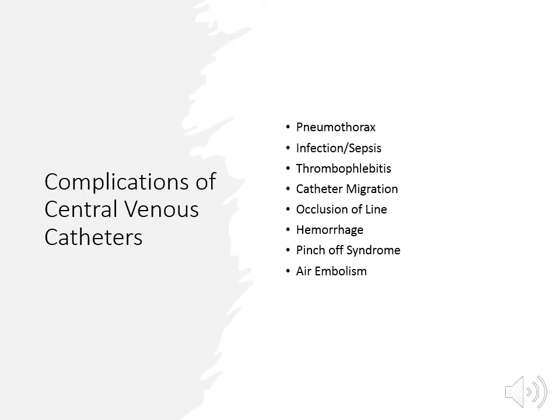Do not force flushes through the catheter. Meds can be instilled in the catheter to dissolve the clot. You would need a doctor's order for that. The current most effective medication is Alteplase. It is a tissue plasminogen activator, aka TPA. The dose is 2 milligrams per 2 mLs instilled times 2 hours.